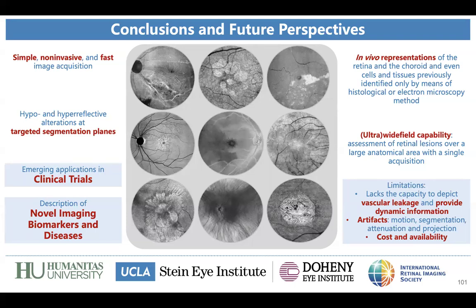It's very difficult to go beyond 80 or 90% of reliability and accuracy. So hopefully, if we can train artificial intelligence systems to detect diseases better and better, I think this would be a game changer. So absolutely. What do you think about that?